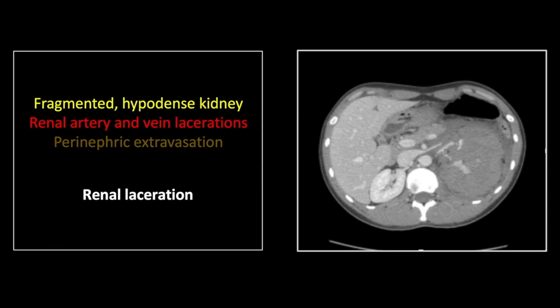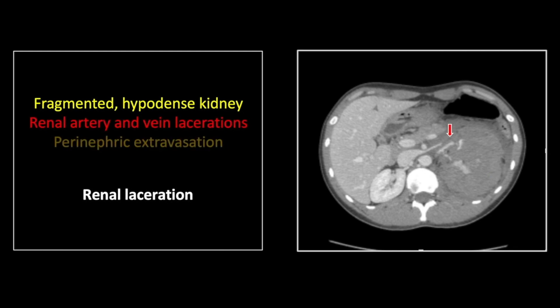On the next cut down, you can see a large amount of heterogeneous fluid occupying the left renal fossa, and you can see the disrupted ends of the distal left renal vein and left renal artery, both seen here. There are also regions of extravasation emanating from those disrupted vascular ends.